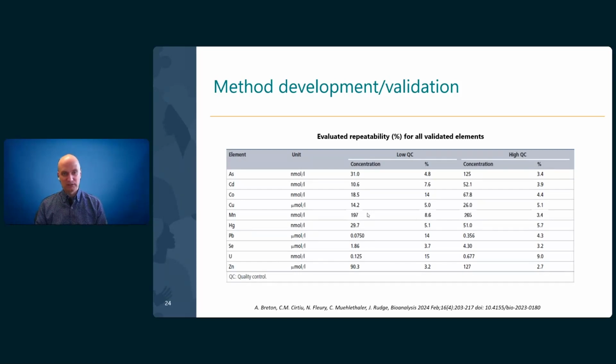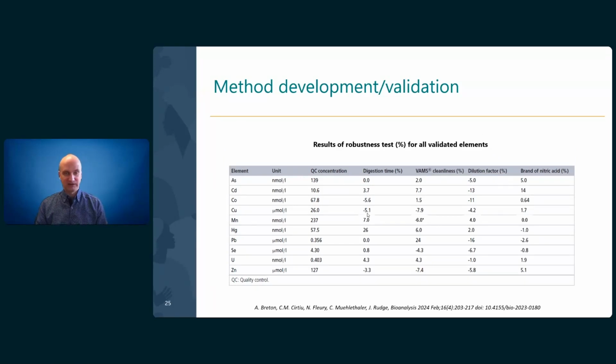We also assessed the repeatability for these elements at two different levels, with a low QC material as well as with a high QC. It works very well for most of them. And finally, the robustness test for the validated parameters.